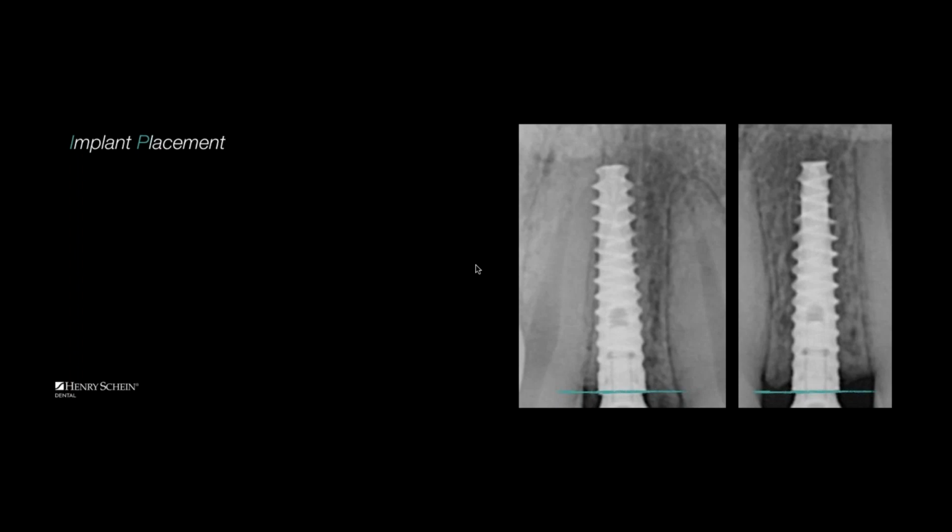But in a radiograph, we cannot see soft tissue, so we make an approximation that if you look at the adjacent CEJs, you measure 3 to 4 millimeters apically, that's where the head of the implant should be. When we look at these 2 implants, we notice that they are actually coronal to the adjacent CEJs. So maybe these implants were placed a little too shallow. And then we look at this closely and we see that these are actually 3.0 diameter dental implants. And a fun fact about 3.0 diameter dental implants, we don't make zirconia abutments for 3.0 diameter dental implants.